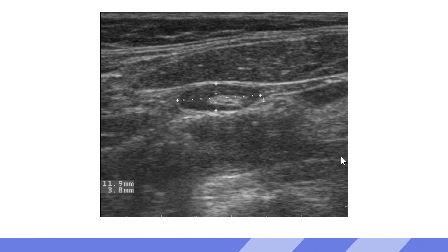As you're sweeping through the neck, just double check all those things you know to be normal for lymph nodes. Again, if we came across something like this, we'd say yes, it's got a fatty hilum — that's a really good first step. Cortex looks really good: it's hypoechoic, homogenous, thin, and symmetrical — that also looks very normal. Put color on it and we'll see hilar blood flow, again proving that it's normal.